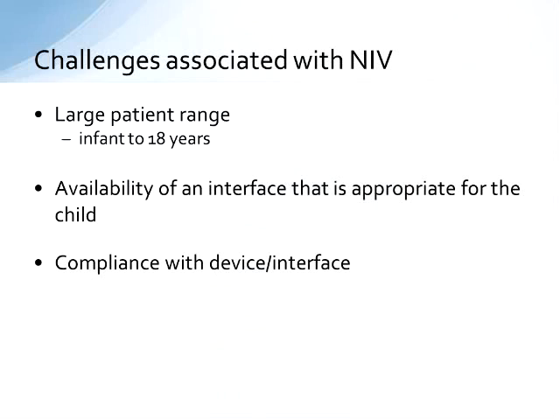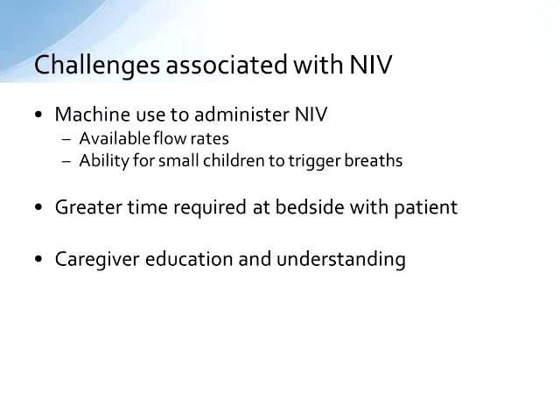So finding an interface, a mask, nasal prongs, whatever it may be, to fit the child can be extraordinarily challenging. I actually find that kiddos under the age of 5 are probably the most challenging to fit. And then compliance with the device. These kiddos, they're little, they're often scared, maybe they don't understand exactly what you're doing, and so that can be really challenging to make them understand the need to be compliant with the device and with the mask.